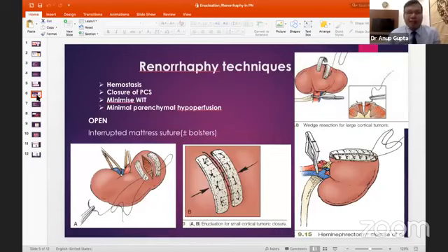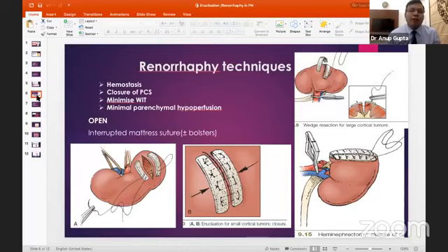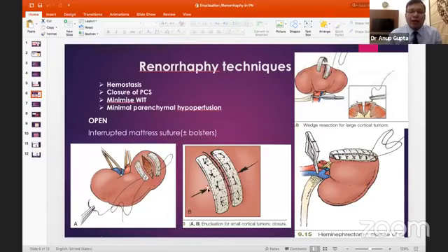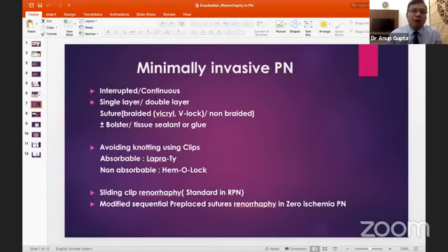Regarding renorrhaphy techniques, the basic aim is to achieve hemostasis, ensure good closure of the pelvicalyceal system, minimize warm ischemia time, and minimize parenchymal hypoperfusion. In open surgery the gold standard was interrupted mattress sutures with a bolster. In minimally invasive surgery, we can use interrupted or continuous sutures, single or double layer, with monocryl or V-lock sutures.